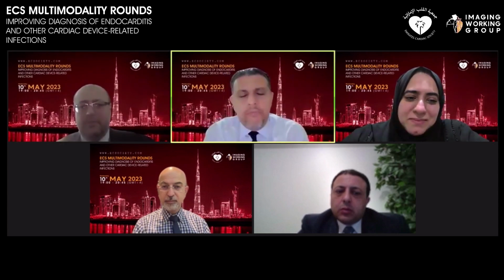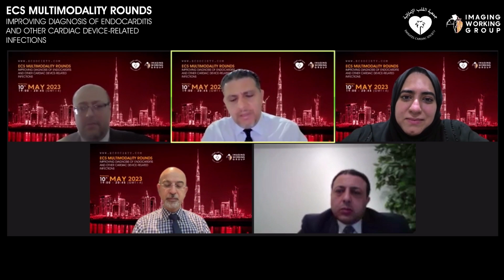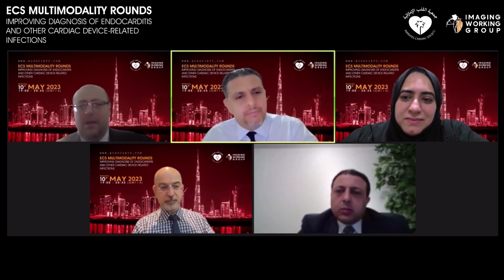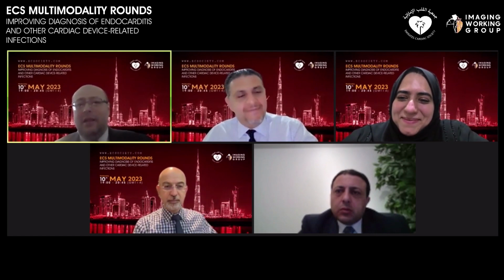Mu'adh, any role for tagged white cell scan in the workup of endocarditis? It is often mentioned, but it didn't come up in this discussion. So I actually had a slide on it. I took it out. A tagged white blood cell scan actually is a good tool, and usually it is more specific than FDG PET, but less sensitive.